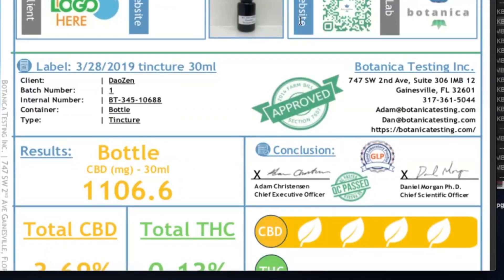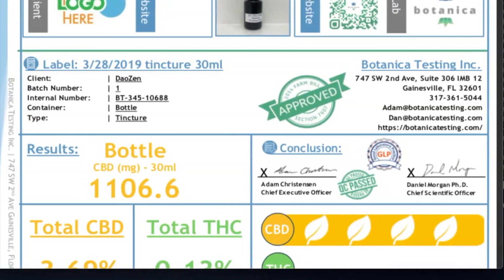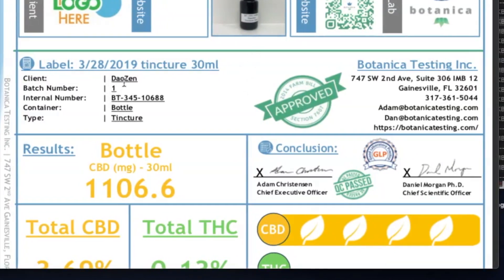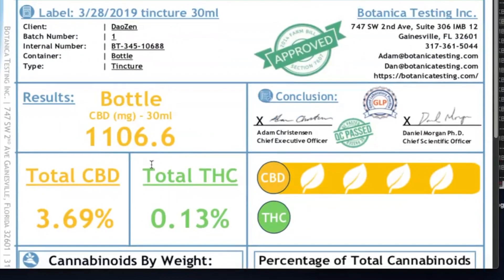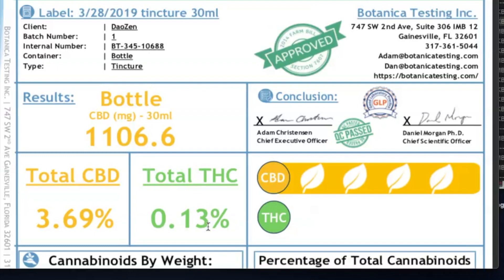I'm going to hop onto my computer here and pull up a couple of tests to go over with you guys. So this is the first one we are looking at — one of our lab results from one of our products. As you can see, it's a thousand milligram product. It's got all the CBD that you want, and you can see the THC content is below the legal limit of 0.3%. Then you can see the different levels of cannabinoids that it's testing for.